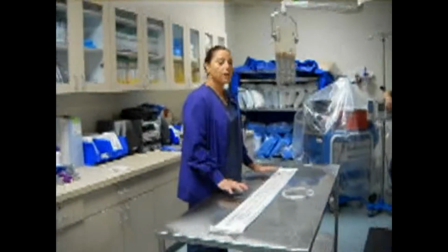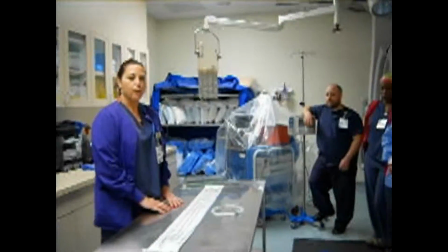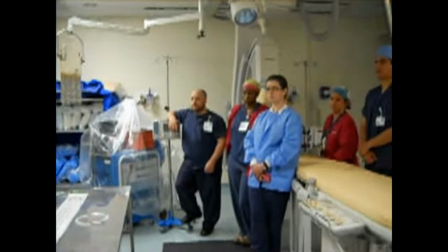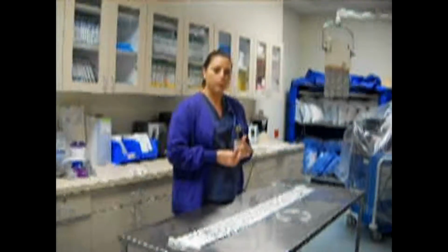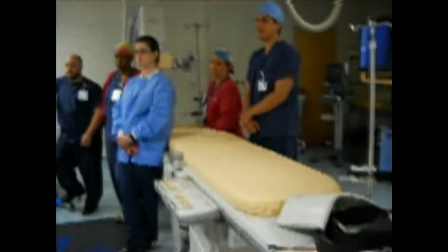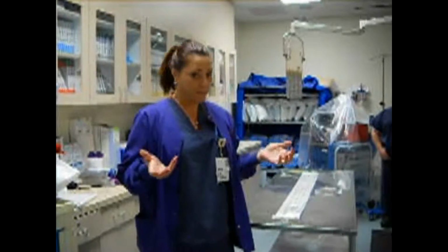So to begin with, you would go into our pre-op area, and there they would shave your access area, whether it be your wrist for your radial artery or your groin for your femoral artery. And they would pre-op you with some medication, some Valium and Benadryl. After that, we would bring you into the lab and put you on our table. This is our table right here. We would prep your groin area or your wrist area with something called ChloroPrep, an alcohol-based skin prep. We do this in a sterile fashion because we don't want you to acquire an infection.